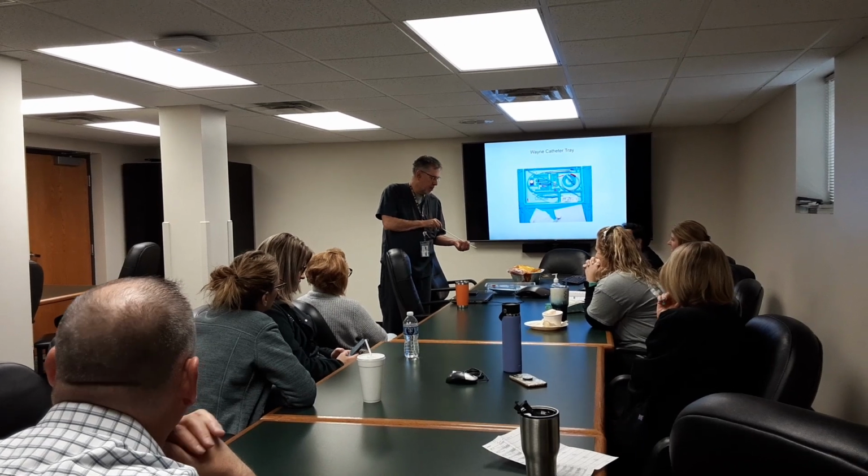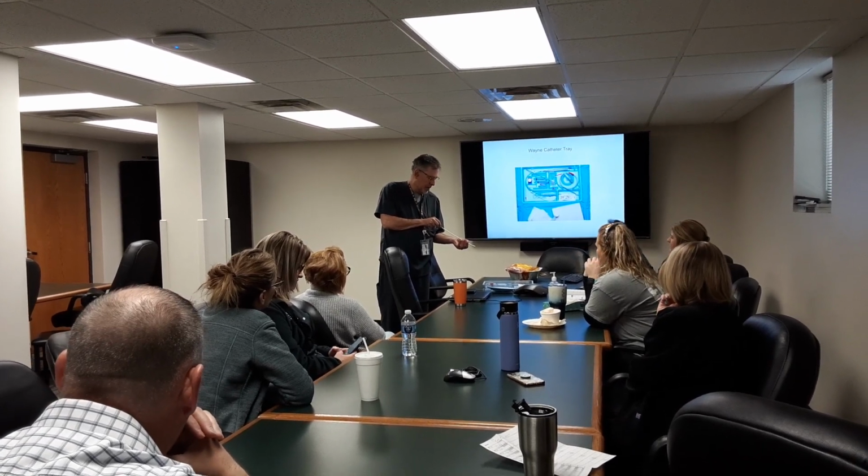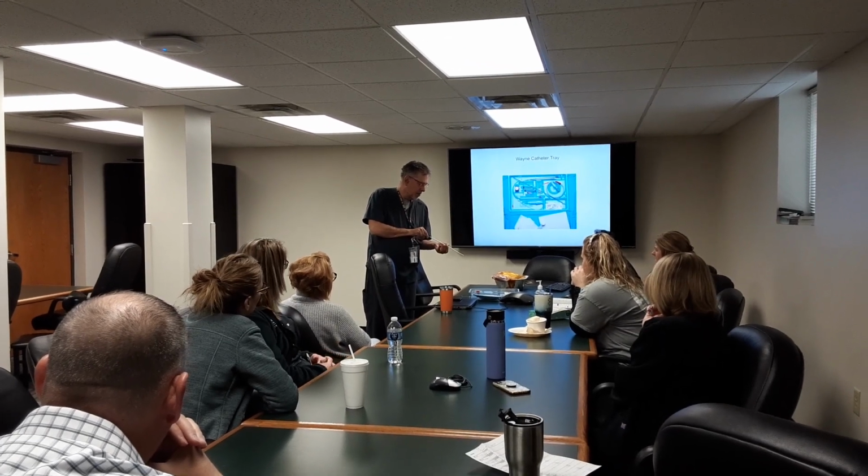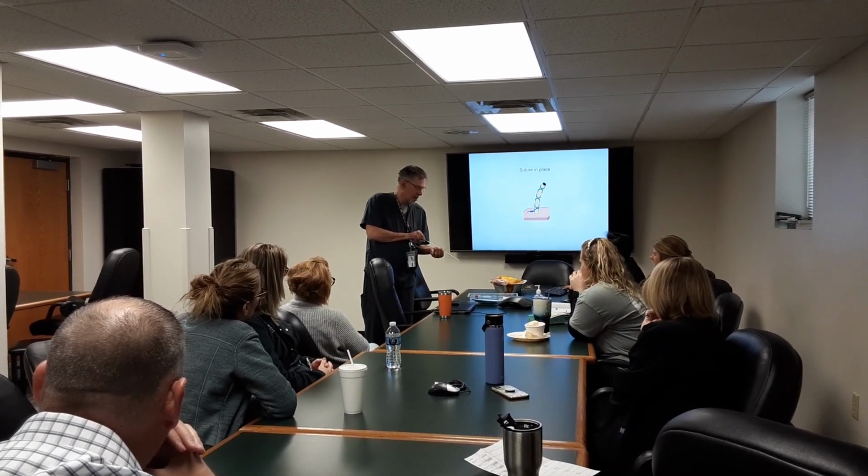So you want to just advance it across the wire until you get in, and you can see, you want to get all those holes into the chest, right? So you're going to put this tube typically down to, this is supposed to be small, medium, large person.